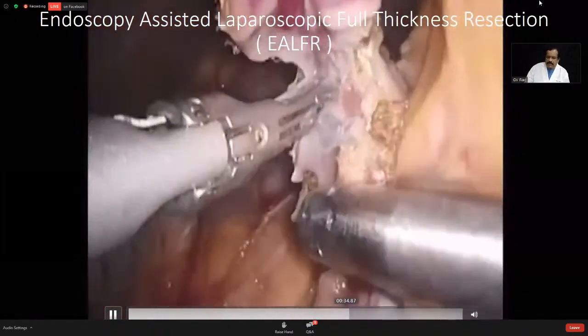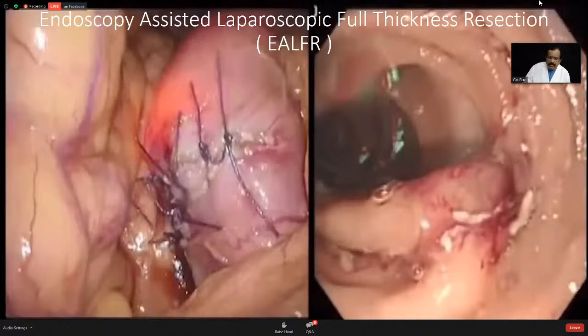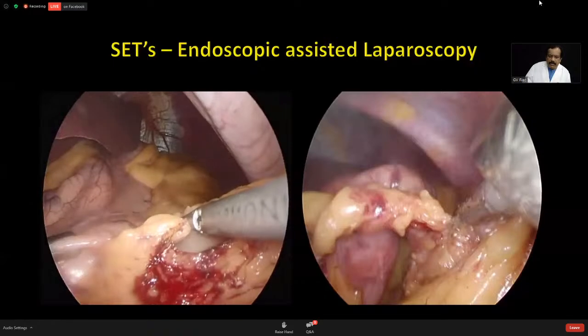So this is the big advantage. But I'm sure in the days to come, with increasing expertise on the endoscopic side, a laparoscopy can be avoided in this. And you can see this full thickness resection. Philip has shown you a lot of data, good results, excellent results with minimal complications.